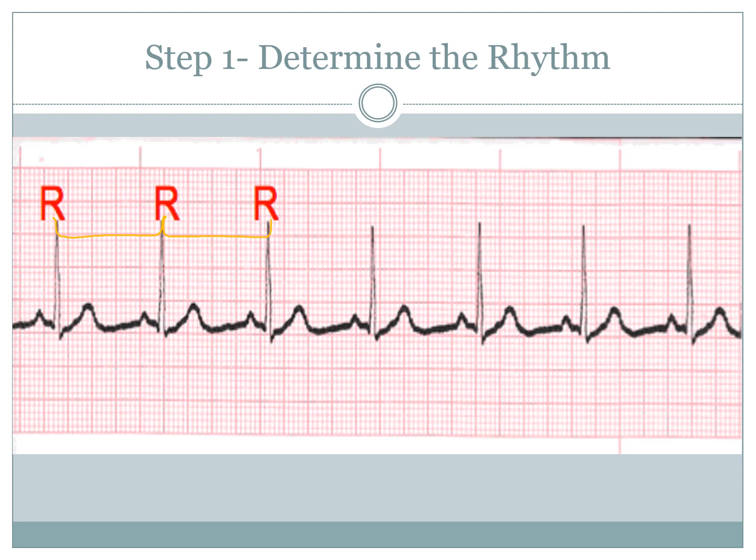If it's not consistently the same distance, then it's known as irregular. Later on you'll learn that irregular doesn't necessarily mean catastrophic, and that's when we start moving into the different pathways. Now, you can get a rhythm that is regularly irregular.